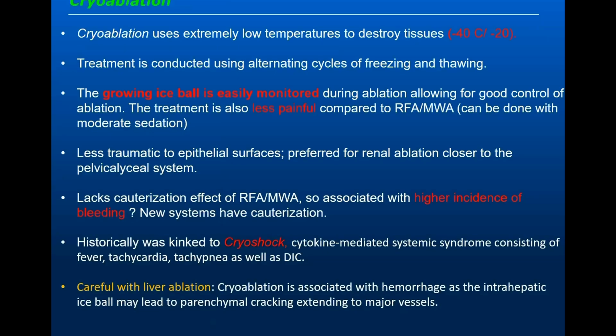Now we switch gears to cryoablation. Again, it appears busy, but we make it very easy for you guys. So this is basically the opposite extreme. With radiofrequency and microwave, we were heating. This time we are freezing. So we are bringing the temperature to a very low temperature, like -20 or -40.